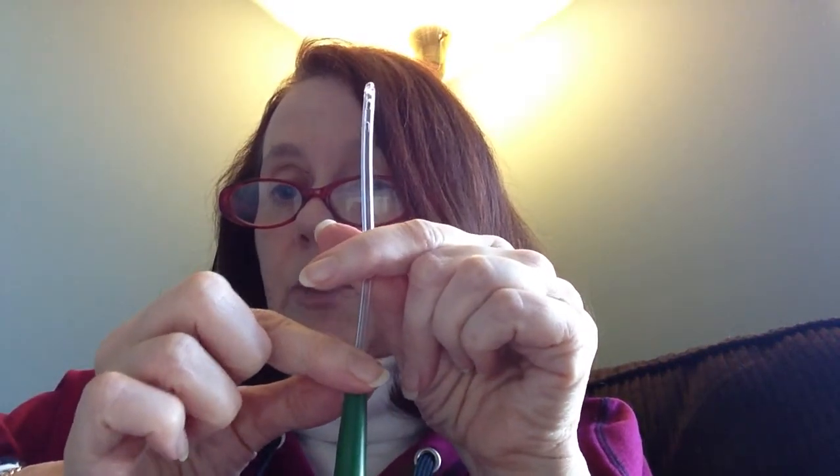I've gotten good enough that I can do this where I insert it partially into my urethra. I turn the catheter up, cover it with my thumb. It's not all the way in at this point, so no urine should be coming out. And again, I have rubber gloves on, or latex gloves. And then as soon as I sit down on the toilet, I let it drop down this way and let it drain right into the toilet.